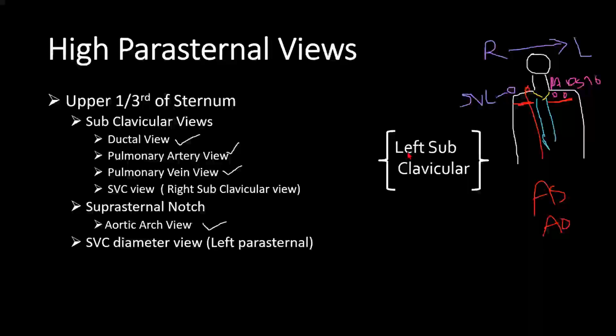SVC, yes. And then left to SVC is ascending aorta. And then left to that is, yes, left to the ascending aorta is pulmonary artery. And the most left to that pulmonary artery is descending aorta. Very nice. Great.